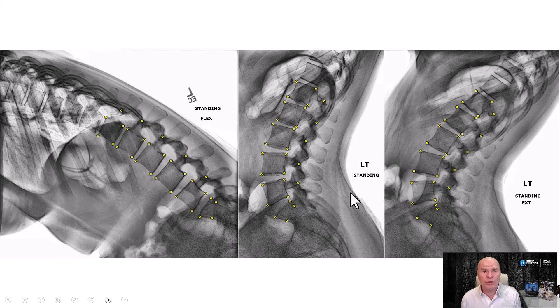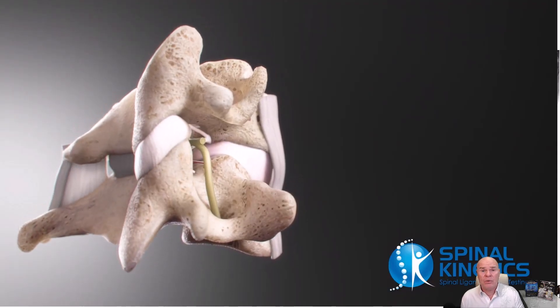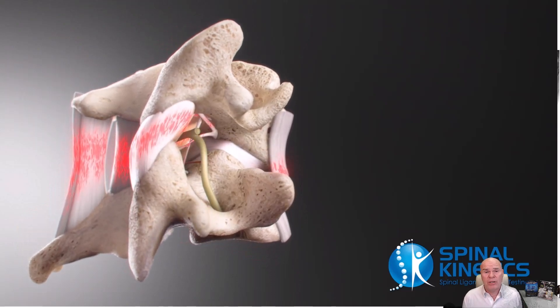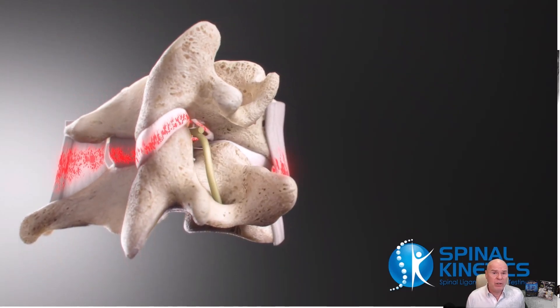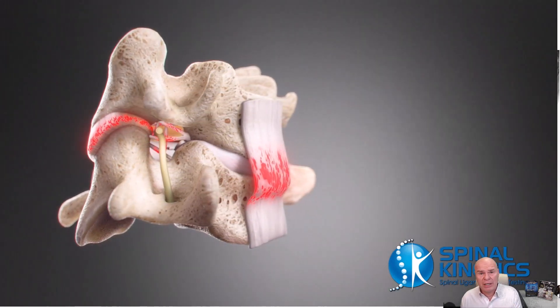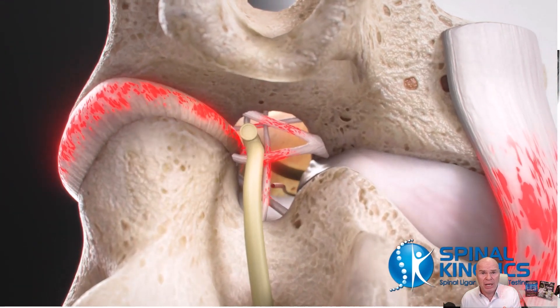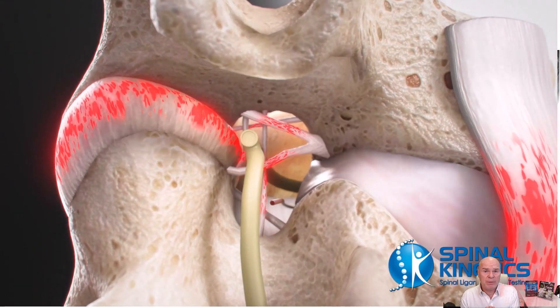What I wanted to do is just go over a simple X-ray critique and make a short video. Hopefully it'll help providers out there. At Spinal Kinetics, we do short critique videos and send them to the provider so they can understand better what the positioning on these images should be — because it's very, very important. Spinal ligament injury is one of the worst injuries a patient can have.